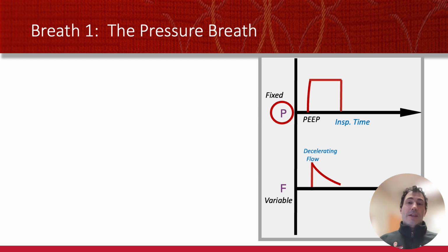And similarly, the pressure in the lung is now more positive. It's equilibrated between the ventilator and the lung. And so how much pressure downhill we're going, that goes down because the pressure in the lung is equilibrating to the ventilator. And my lungs are stretched out and not very compliant. And that gives us a decelerating flow pattern on the ventilator, which we see here. Then the vent turns off and you breathe out. And that occurs in the opposite direction.